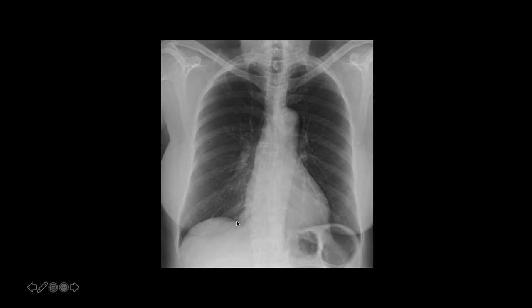Once you've looked through all of that, remember that there are several lines that should always be visible. Here we have the hemidiaphragms, the heart borders — both right and left — the descending aorta, and sometimes you can see the paravertebral lines, though not always.